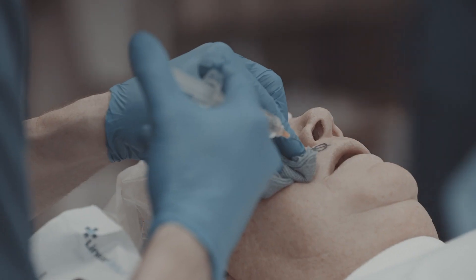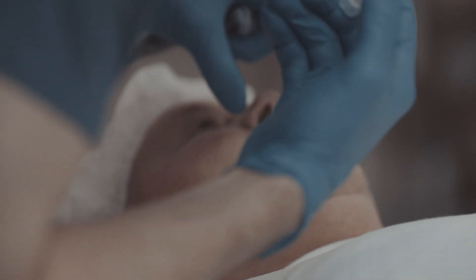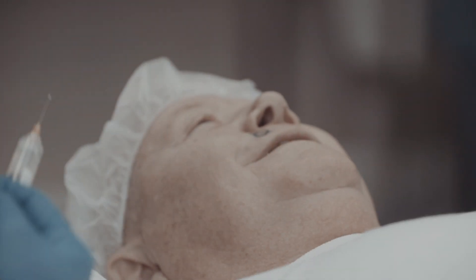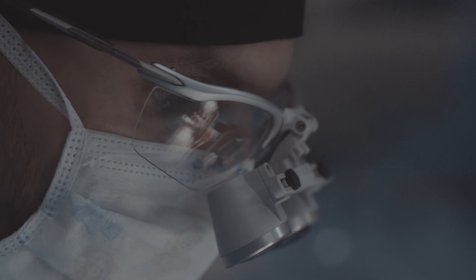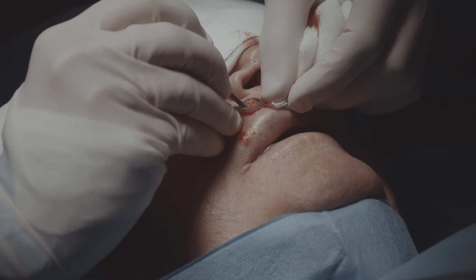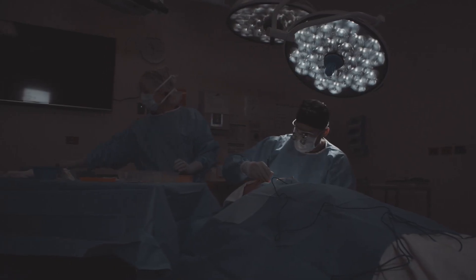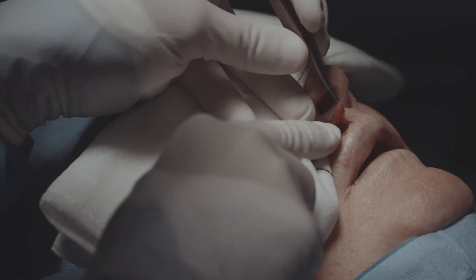We then need to anaesthetise the tissue. In Mohs surgery we traditionally use local anaesthetic — a mixture of quick-acting and long-acting local anaesthetic — meaning the patient becomes numb very quickly and remains numb for the entirety of the procedure to maintain as much comfort as possible. We then prepare the area in a sterile field in a large theatre setting to keep the infection rate as low as possible.